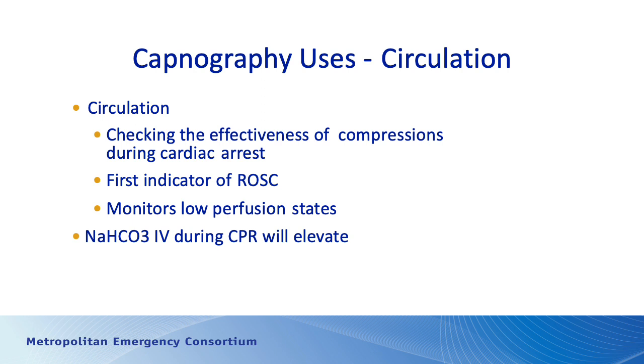That's particularly true for patients who may be volume depleted. They just don't have enough circulating volume, so the capnography values may be low, even though they seem to be breathing adequately. So another thing, just as a sidebar caution, we use sodium bicarbonate during cardiac resuscitations.